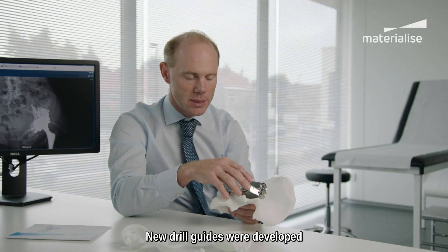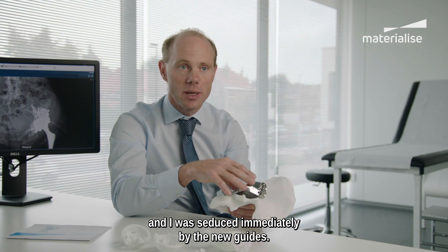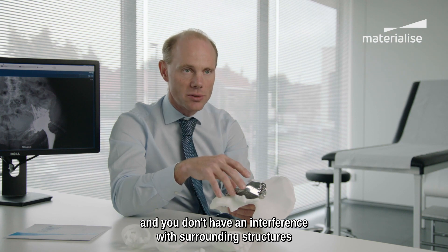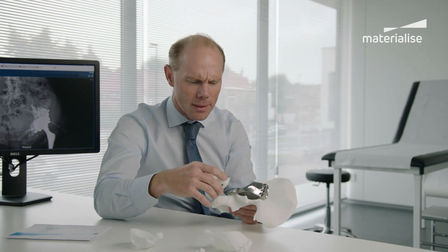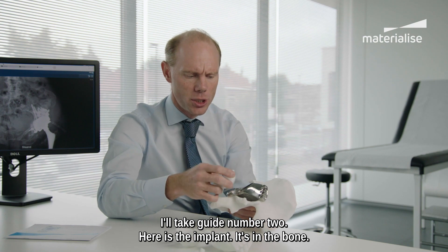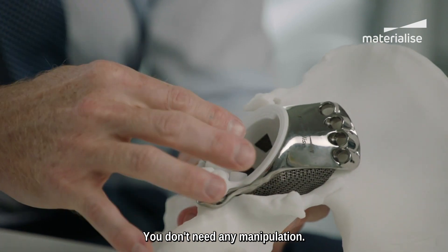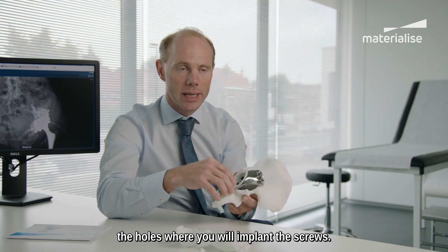New drill guides were developed, and I must say I tried these a couple of times and was seduced immediately. It has been some work to develop them, but they have an immediate fit. They're very stable, and you don't have interference with surrounding structures because the guides fit into your implants. I will show you one of them. This is guide number three, this is guide number two — for that particular case we have three guides. You see here the implant, it's in the bone. This is the drill guide — you just put it in and you see it's stable. You don't need any manipulation, and it allows you to drill straight away the holes where you will implant the screws.